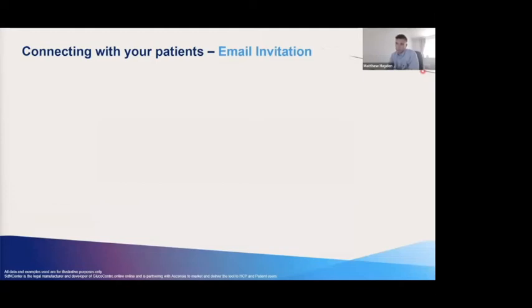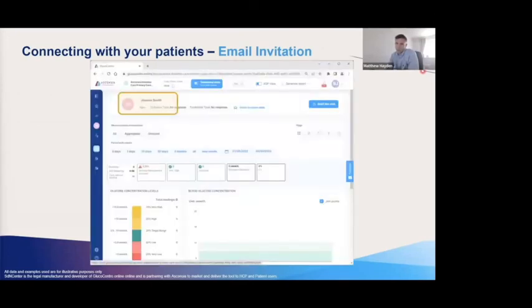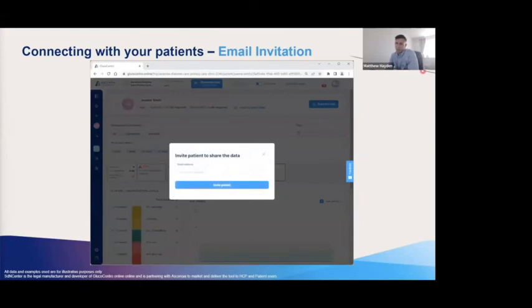For the second option, we look at connecting with patients via an email invitation, using the example of Joanne Smith. Joanne has been testing her blood glucose and bringing her meter to clinic, but she is now interested in using GlucoContro herself. All you need to do is click on the invite to share data button, which brings up a box for you to input the patient's email address. Once you've entered the email address, click the invite patient button — the patient will then receive an email asking them to create an account and agree to share their data with their healthcare professional.